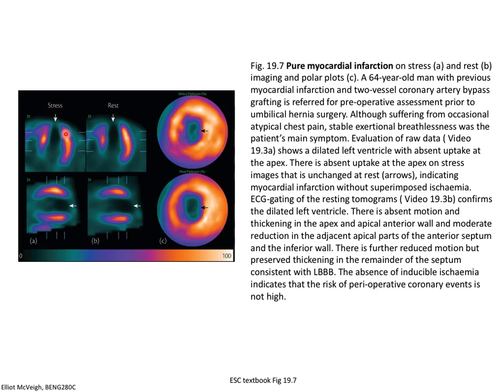And yep, we induced it in the stress test, but then when we let the patient recover from the stress and we image them at rest, lo and behold, it's still there. That deficit is still there. So this is called a fixed deficit, and it is indicative of a scar or an older infarct in this person's heart. And if somebody comes in and they're 68 or 73 or whatever, and you're imaging them and you see these, it's not that uncommon that they've had a heart attack before and they have these scars in their myocardium. Some people don't even know they had a heart attack.